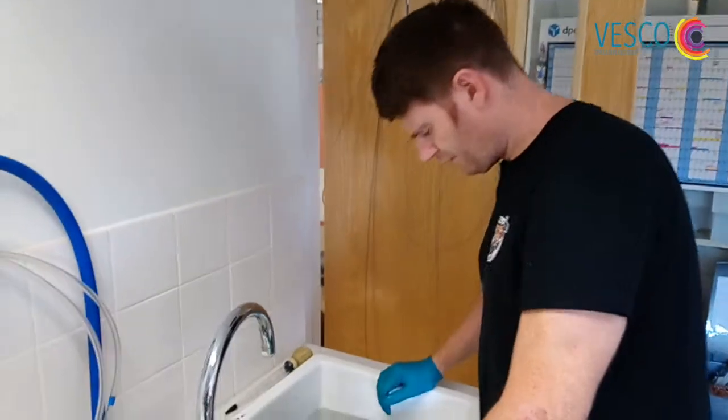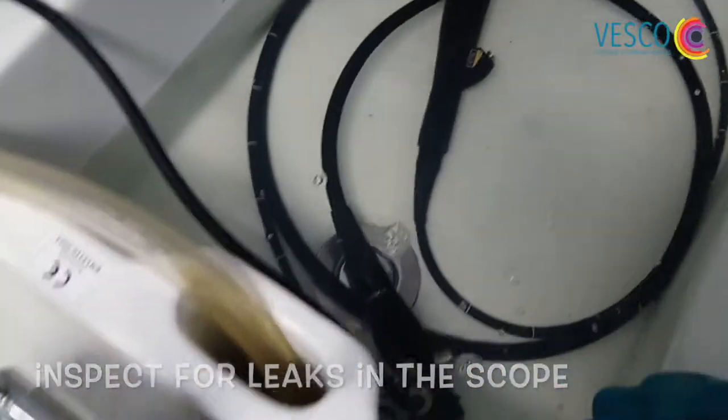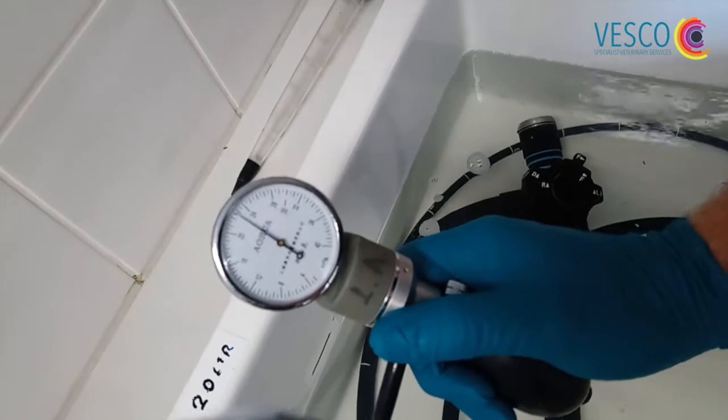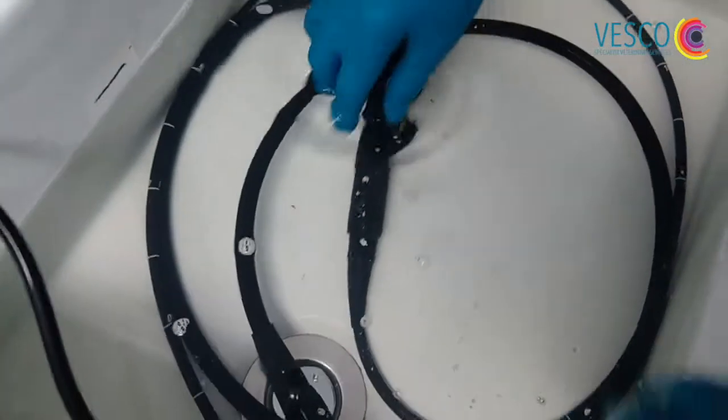When I'm confident that the scope is fully flushed so there's water in the channels, I can then look for any streams of bubbles that will indicate a leak. I can check my leak tester to ensure that it hasn't lost pressure. There is a slight change in pressure there, but that could just be due to atmospheric reasons or the temperature of the water. So now I can look for leaks.